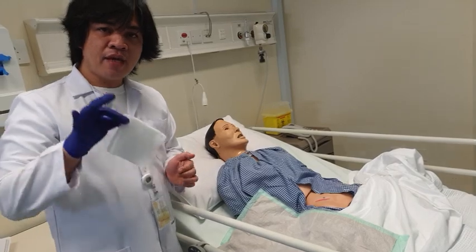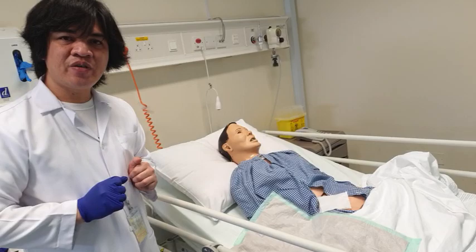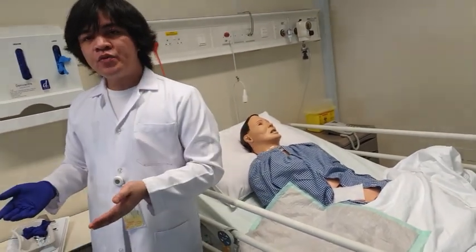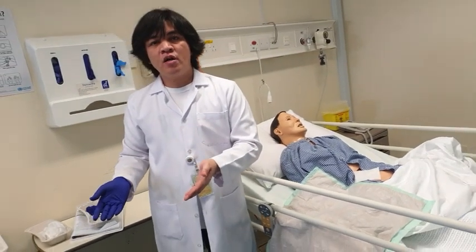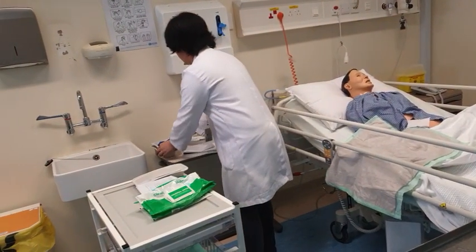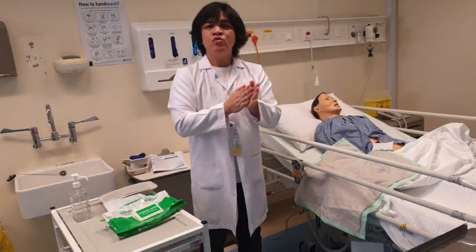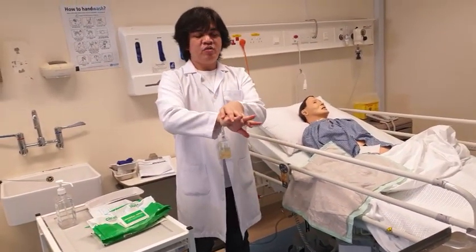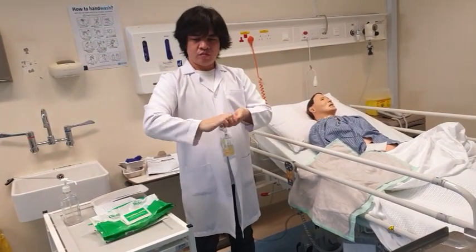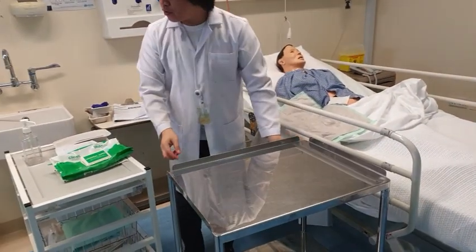After you do your assessment, you get your gauze and cover the wound. At this point, the wound is covered. We can now proceed to preparation of our materials. So remove your old gloves. Do your hand hygiene. And we can now start setting up the table that we have for our patient. So here's the trolley that we're going to use.